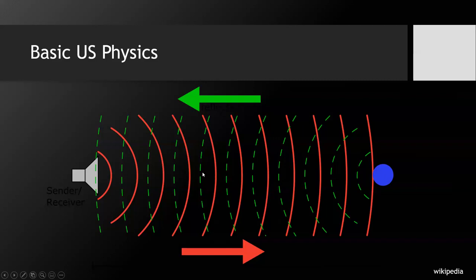Note, by the way, that frequency is not the same thing as speed, right? Frequency is just how many times you get a wavelength in a second. So the speed that the echo is reading is basically, we know that the speed of sound through soft tissue is 1540 meters per second, which you don't need to know because it's in the echo machine.